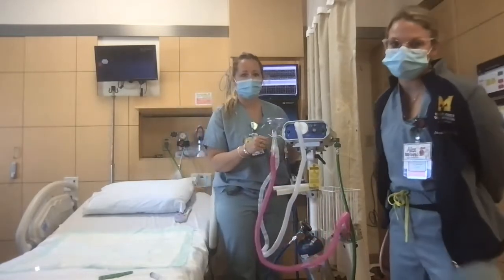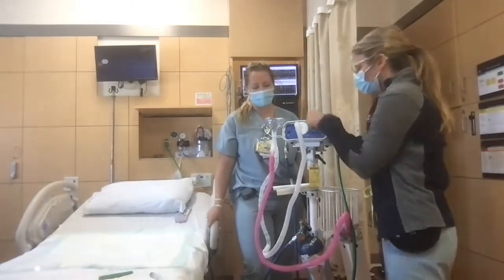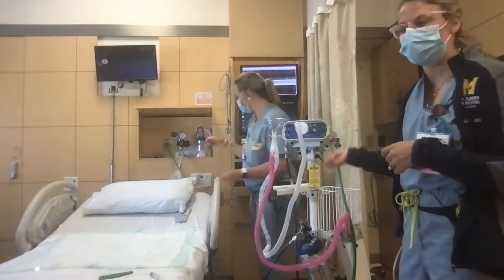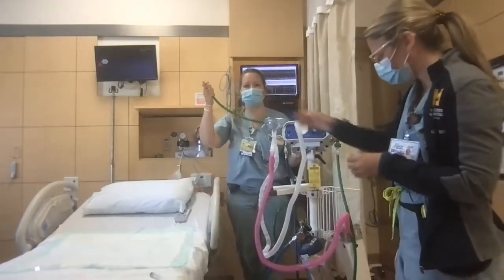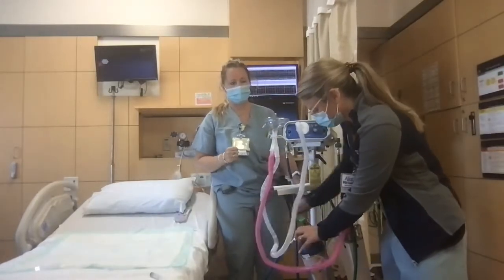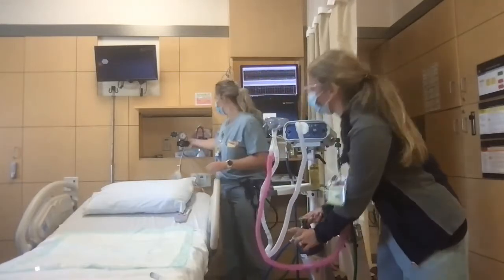To disassemble the nitrous when your patient is done using it, we'll start by turning our machine off. Then we're going to do the opposite. First, we're going to disconnect from the oxygen prior to turning off our nitrous tank. So we've disconnected from the wall unit. Now we can turn the nitrous tank back off by turning to the right. At this time, we can also turn off our suction.